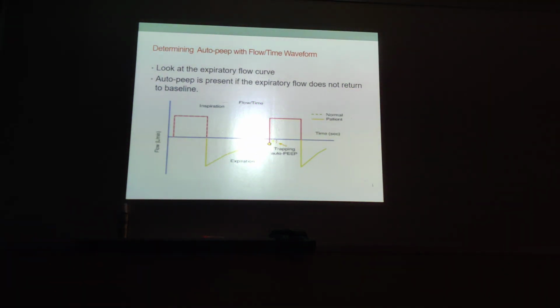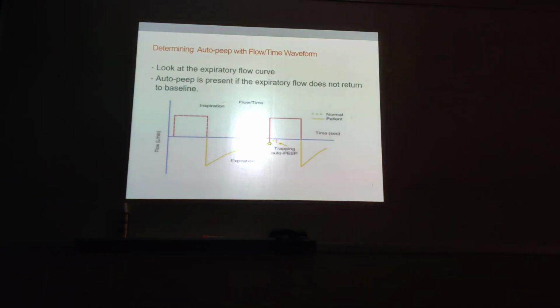Okay, this is the most important of everything that we're doing today because it's always on the exam. That's air trapping, okay? You see it there because as a respiratory therapist, you're supposed to know when your patient is air trapping. Now, this is inspiration from here to here. This is exhalation here. Anytime the patient is exhaling and there is any flow left in their lungs, then they're doing air trapping.